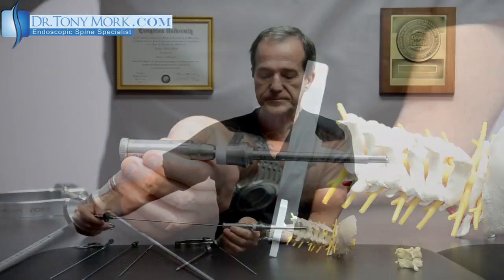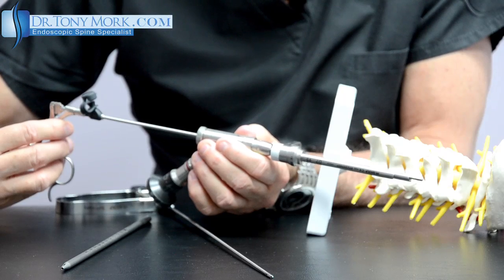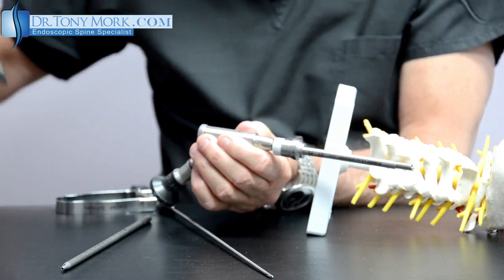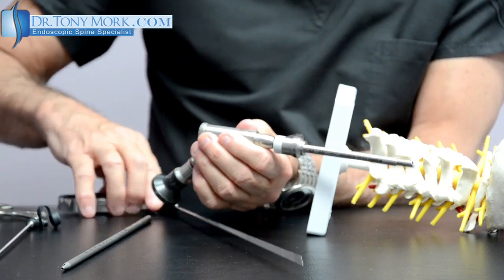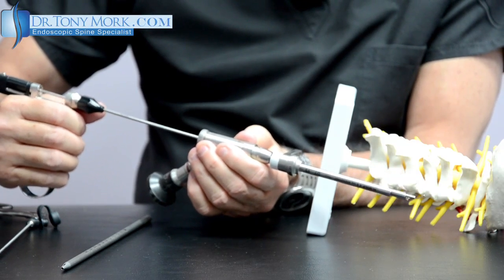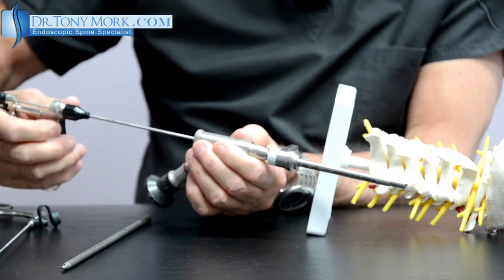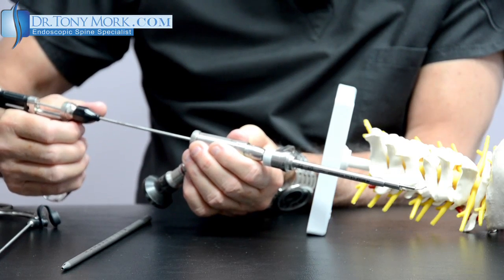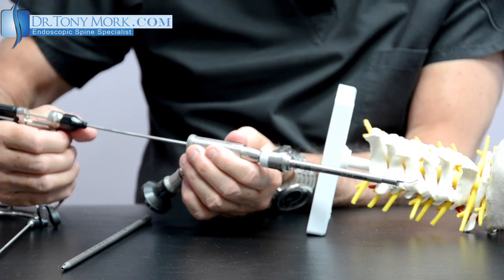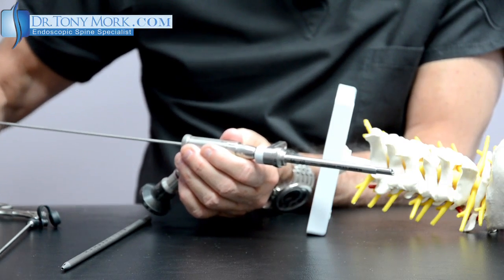Once this has been done, anything that needs to be grabbed — small fragments of bone, disc, or soft tissues — can be grasped and removed right through the endoscope. At the end, there is a probe which can be passed through and moved around to loosen or identify anything else that has to be removed. This probe will ultimately be used to identify the channel: once the bone has been removed sufficiently, a ball-tip probe like this should be able to pass freely through the foraminal canal, giving us a sense that we've completed the foraminal decompression.